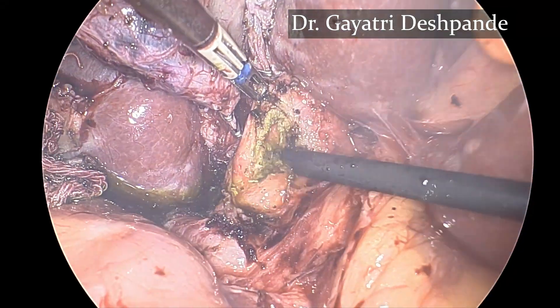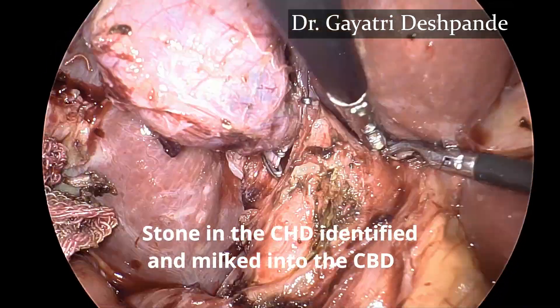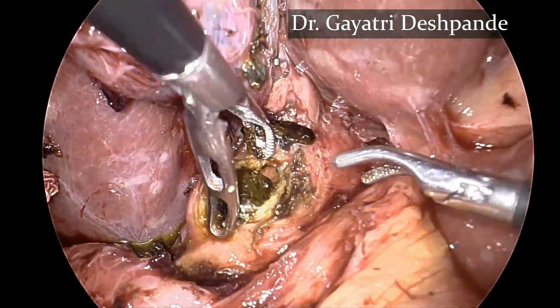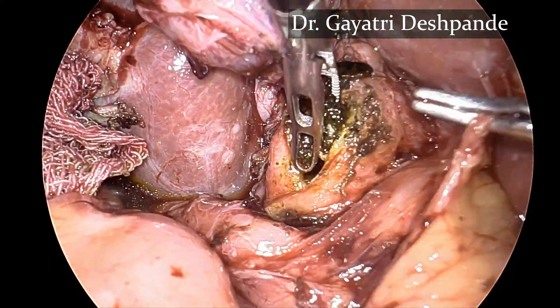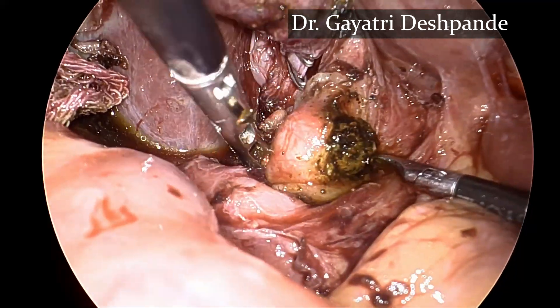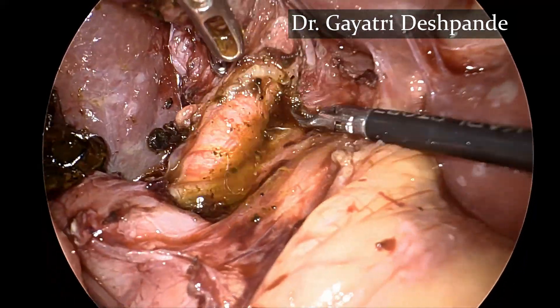After adequately opening the common bile duct, the stone can be seen. The stone was milked into the common bile duct gently and then removed. The stone was removed carefully to prevent crushing.